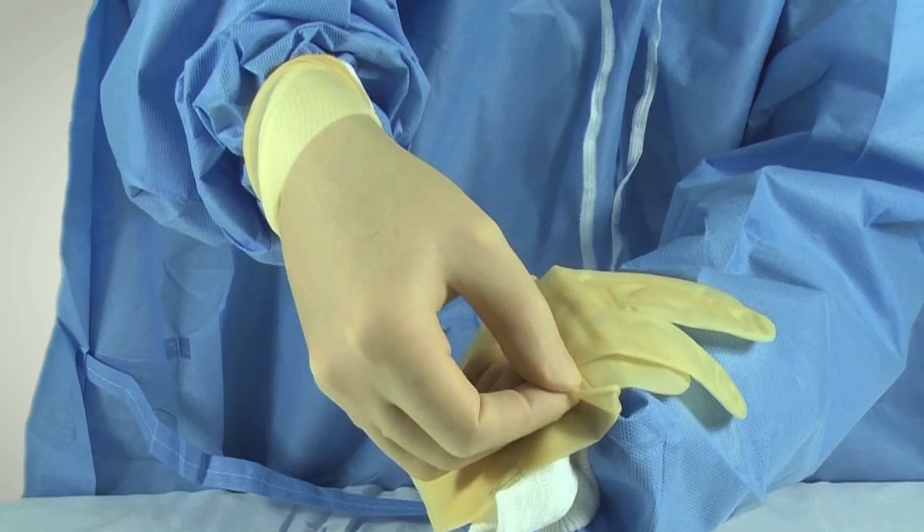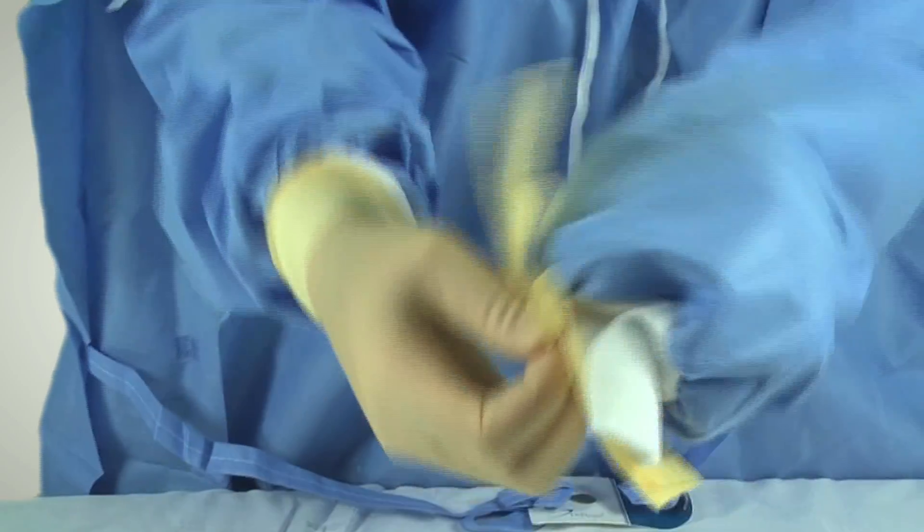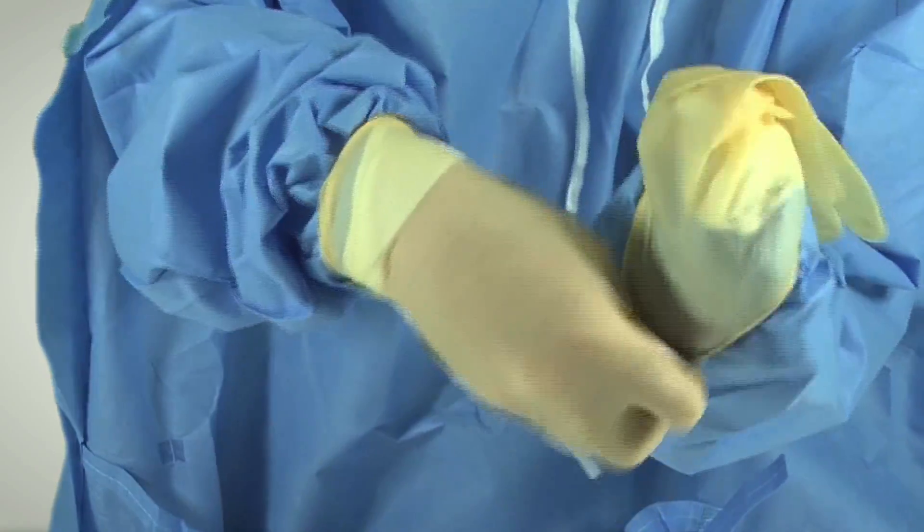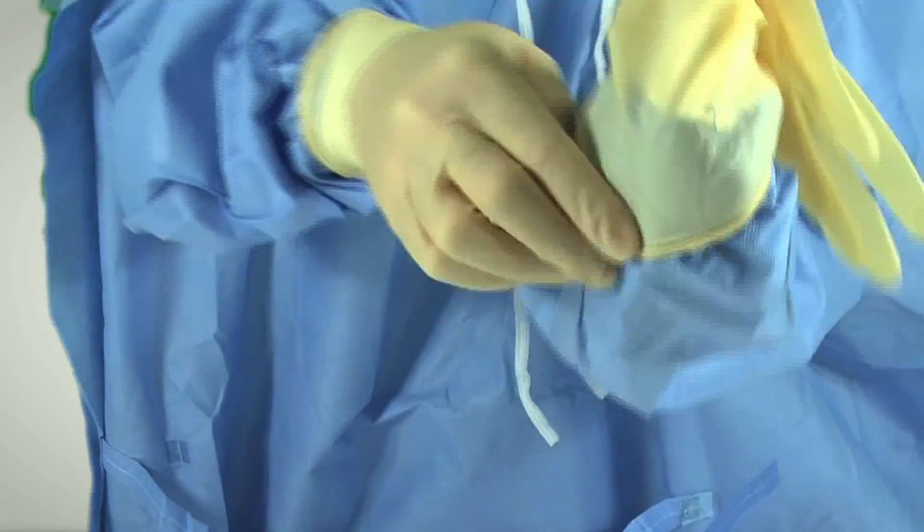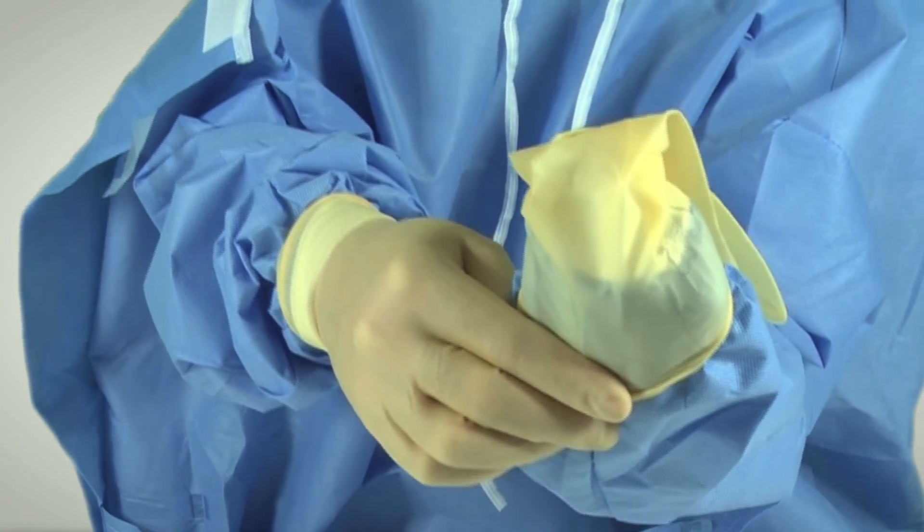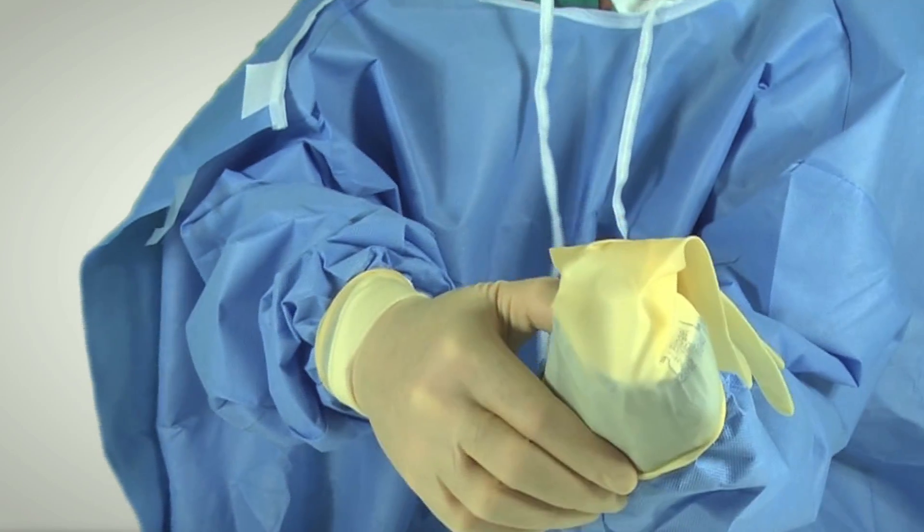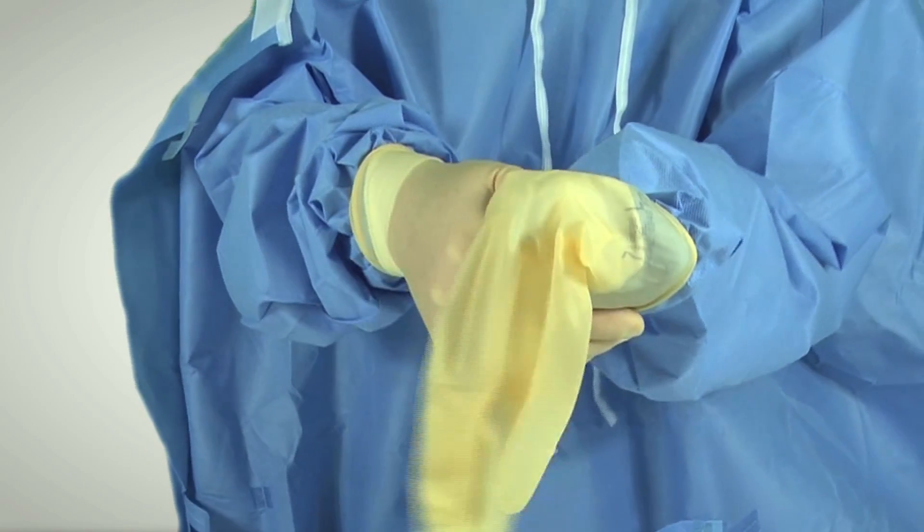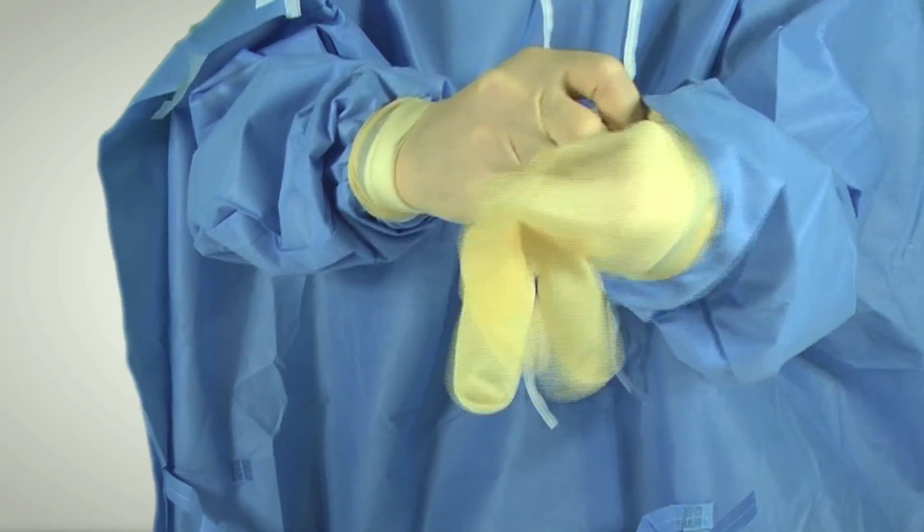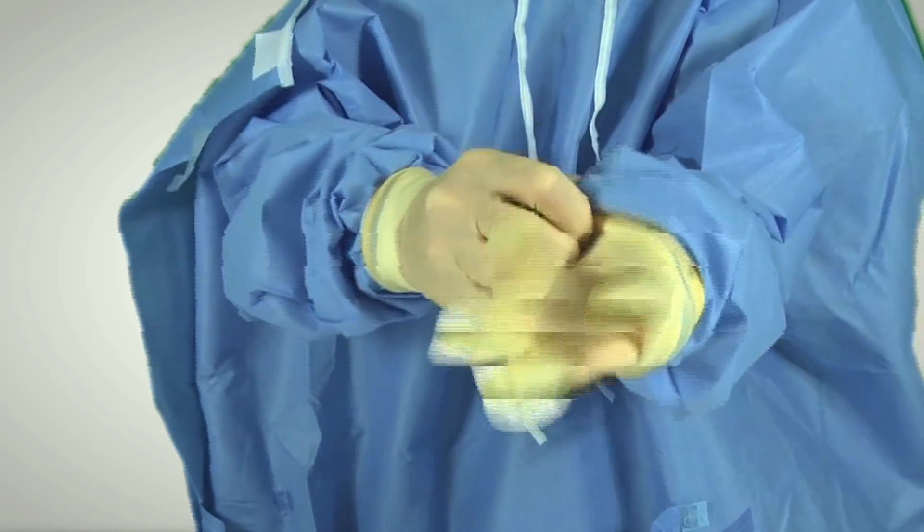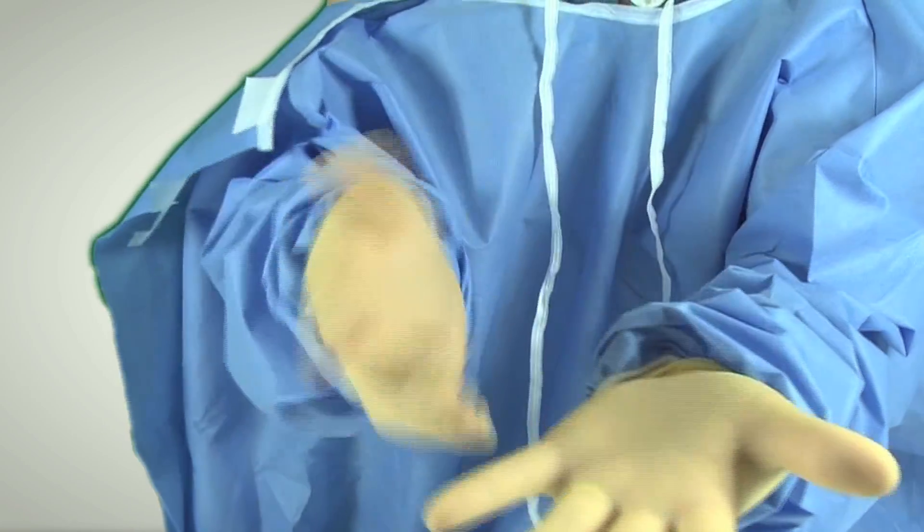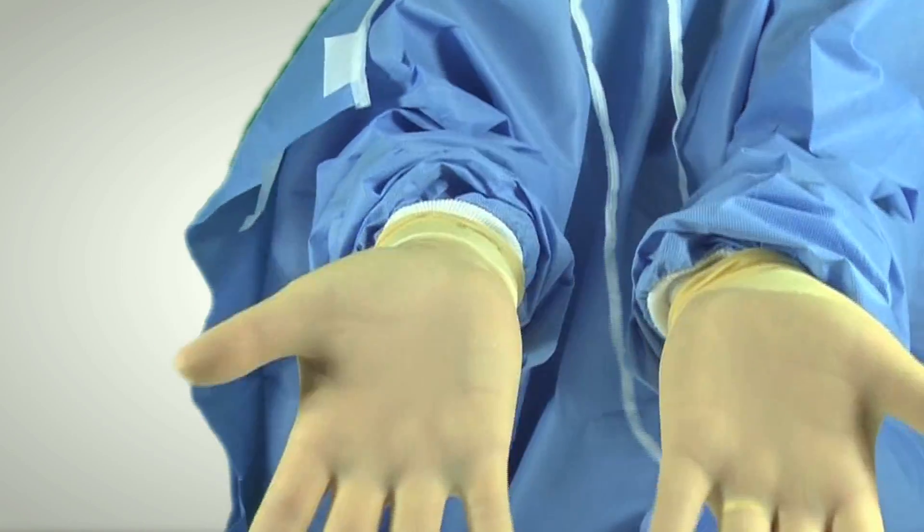See how I'm just grabbing the two edges? I grab this edge, I'm emphasizing, and this edge. Now, if I just quick flip this over, boom. Now I have completely covered this hand. See, the skin can't come out anywhere. I've completely covered this hand, so I can't contaminate anything. And then I do this one quick little maneuver to get the fingers pointing down. Now I can grab here, and you'll see that I can then, see, pull the thing all the way up. And the white part isn't way up high here.